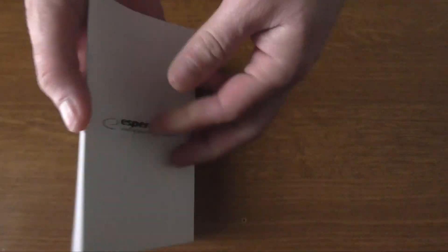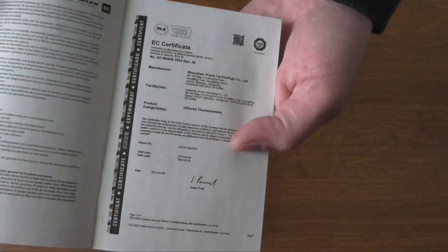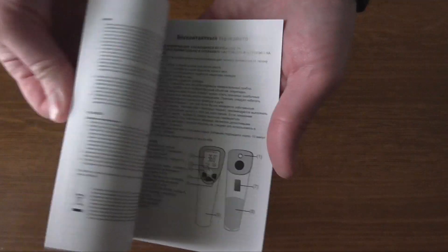Here we have the manual. You should take some extra time to read the instructions and learn how to use it so that you can get the right measurements and be confident about the results you are getting.